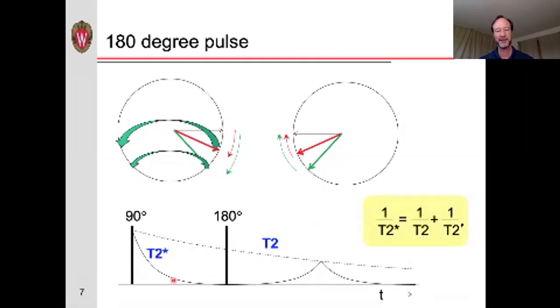Now, historically, the spin echo was actually one of the first ways that they could create an image or collect the signals from an NMR or from magnetic resonance imaging. And the reason for that being that it's very difficult to create a very uniform magnetic field. In addition, it was hard for them, with the early technology, to send in a radio frequency pulse and then switch and acquire the data and apply all the other gradients rapidly enough. So pretty much the signal was gone due to the T2 star decay before they could even acquire any meaningful signal. And so by applying this 180-degree pulse, they could lengthen the time between when they first send in the excitation and when they could start acquiring the data.